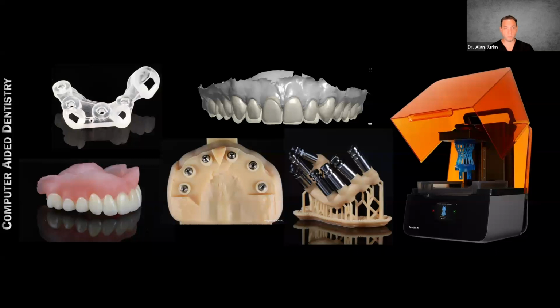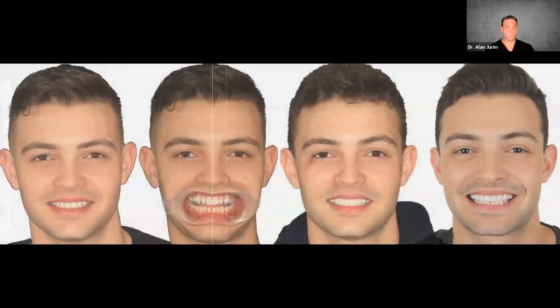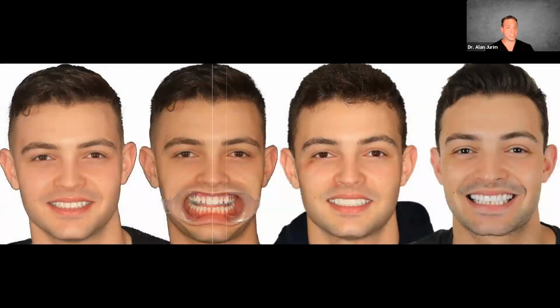So let's go through a couple of cases and examples now. I want to share with you, to begin with, a diagnostic tooth setup. In a case like this, on the left-hand side is the pre-op photo. As we move towards the right, we have our 2D smile design. And really the third photo that we see is the proposed tooth setup. We use that to help influence and determine how we're going to prepare the teeth and where we're going to end up with our cosmetic cases.